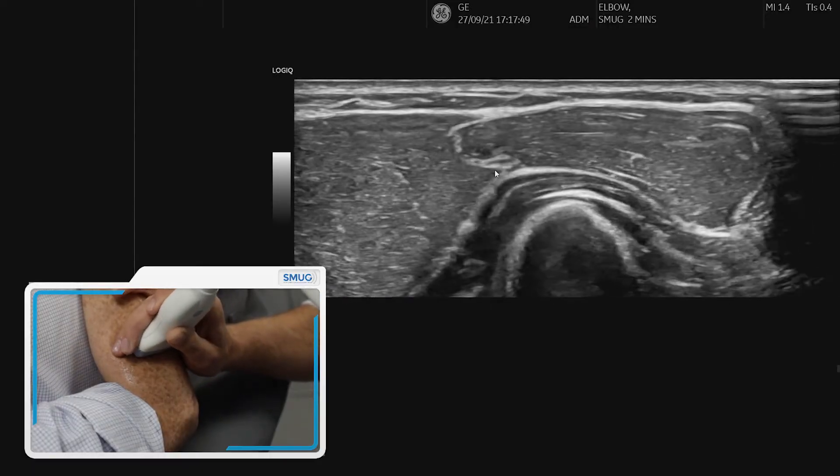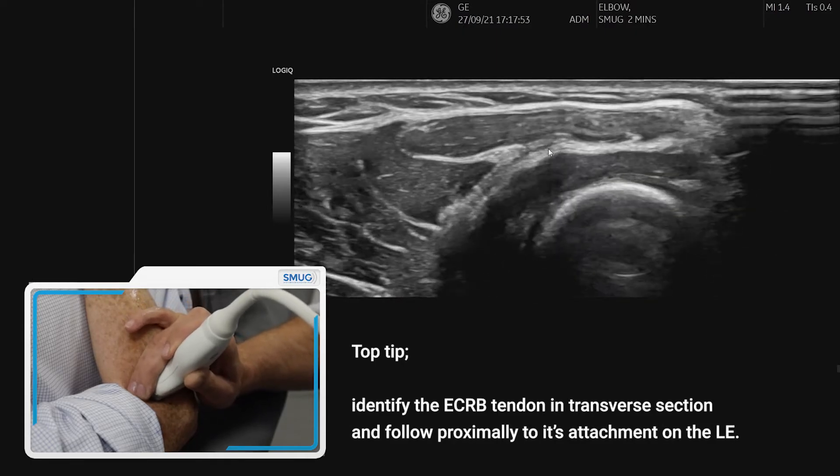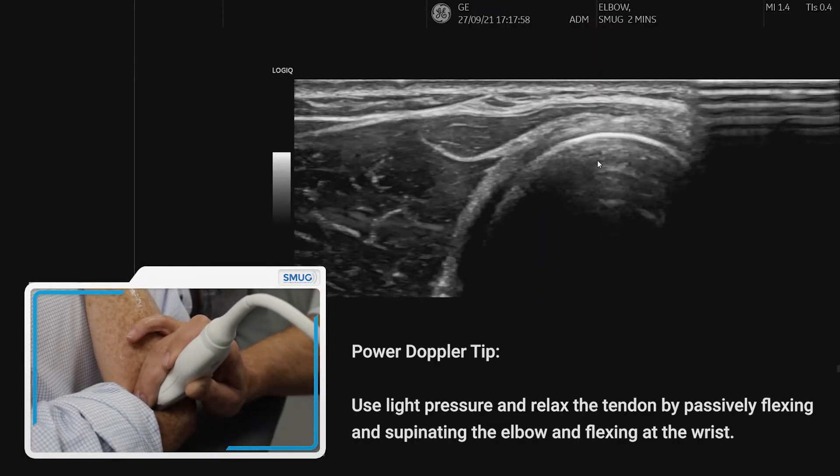So if we move back up, that's extensor digitorum. And as I mentioned, this is the area we really want to follow all the way back up to the lateral epicondyle. We can follow it, trying to tilt the probe past the radial head.